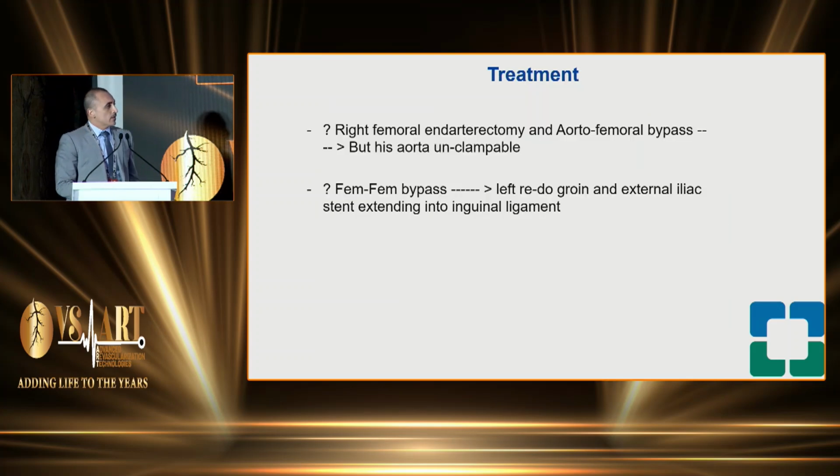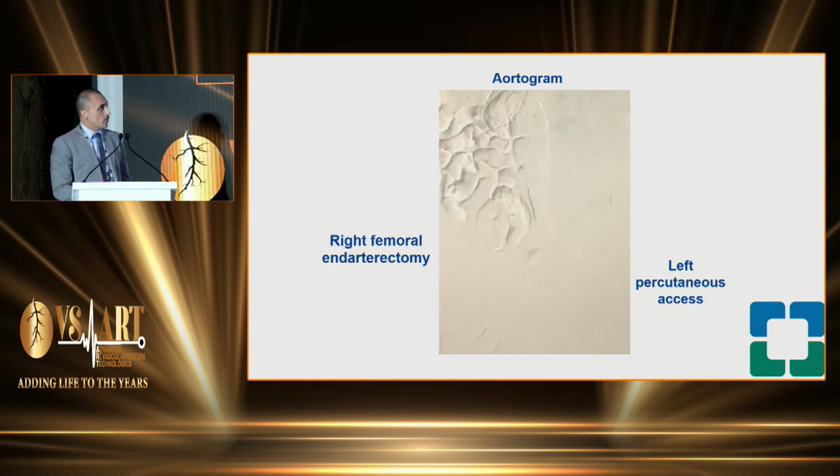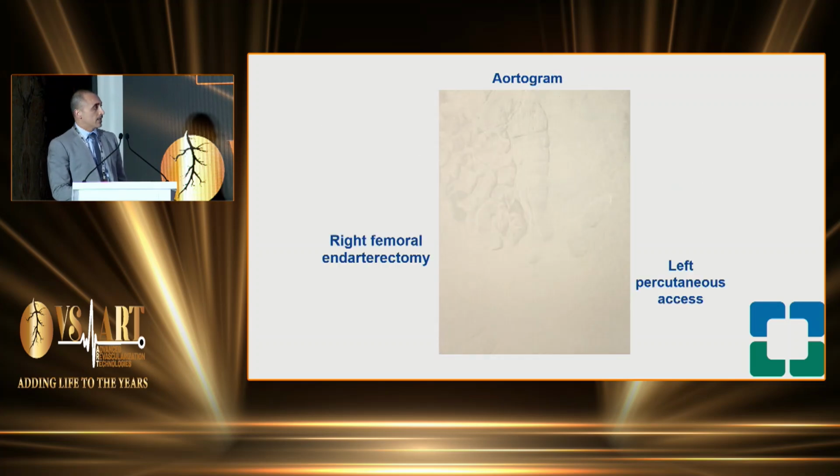Dr. Hassan left, but old is gold, so we thought about it, and we thought, what shall we do? Shall we do a right femoral endarterectomy and aortofemoral bypass? However, the aorta is unclampable. Shall we do a crossover left to right fem bypass with femoral endarterectomy? However, you have to go through a redo groin and clamp the previous stents because they are crossing the inguinal ligament. So we went with the hybrid approach.